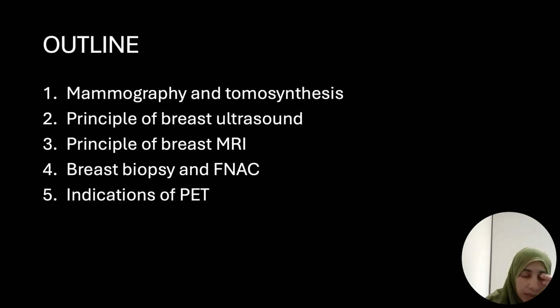Our topic outline is as follows. We'll start talking about mammography and tomosynthesis, followed by principles of breast ultrasound and breast MRI. And then we'll talk briefly about breast biopsies and fine needle aspiration. And finally, we'll talk about indications of PET-CT scan in breast cancer patients.